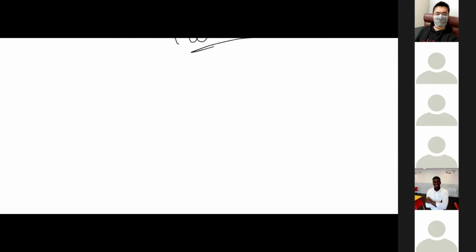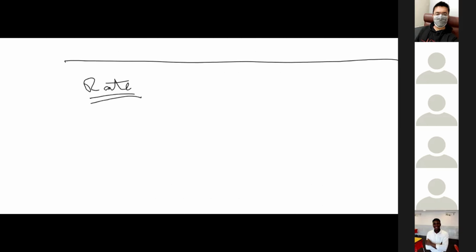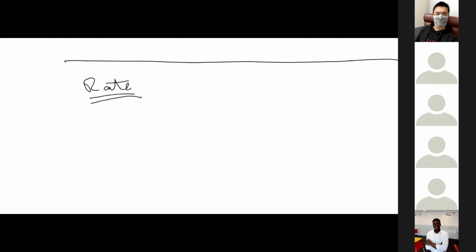As discussed in our resources, when we start interpreting an ECG, the first step is the rate. Now, how will we determine the rate? The first and foremost thing that we should do is the rate. The easiest way to determine the rate is the RR interval.